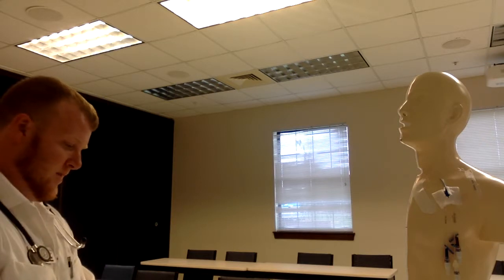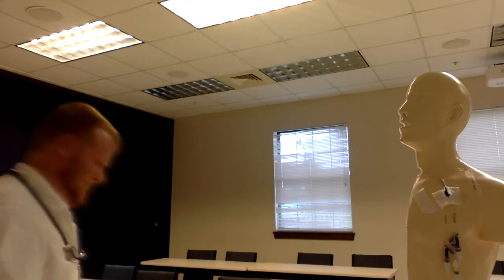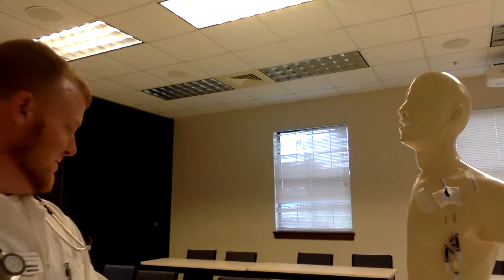To start, I'm going to put my clean gloves on and open my sterile kit. Sorry, these gloves have been used.